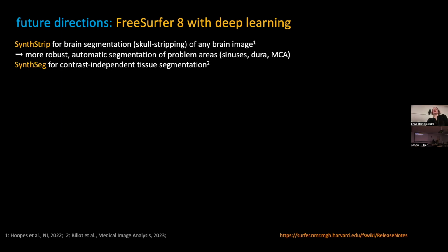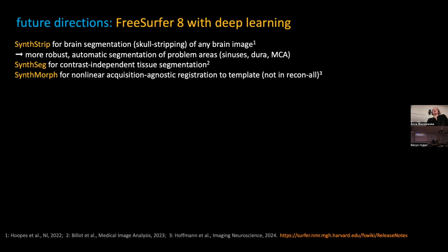The second new development is SynthSeg, which is a segmentation tool, and again, it's promised to be more accurate and deal better with tissue segmentation. We haven't tried it yet, but we are planning to. And just to mention for a complete picture, there's also a nonlinear registration method for registration templates. This is not really part of Recon-All, but it's also one of the new developments in FreeSurfer.